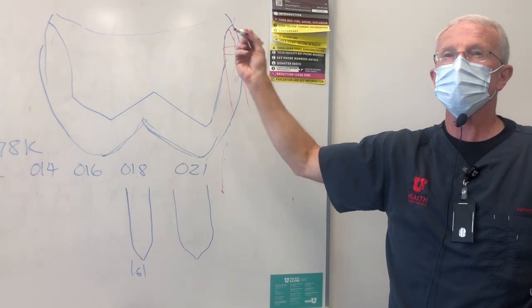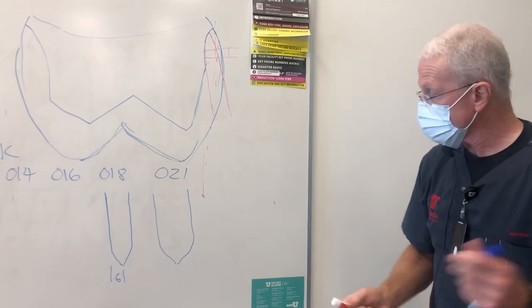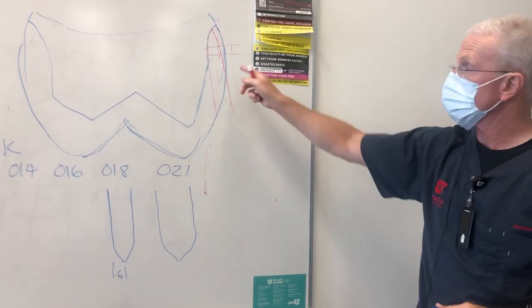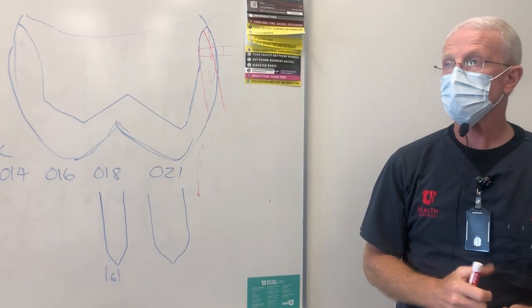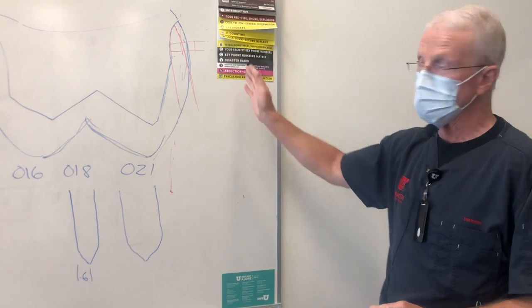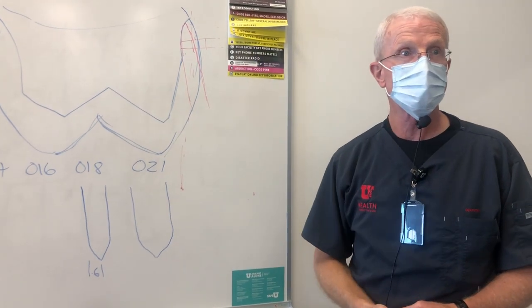So you can't precisely measure a chamfer margin depth without making a preoperative matrix, a reduction guide that you can measure from. And that's okay if you want to do that, but we're not going to be assessing them that way. We're giving you a 0.5 millimeter range that we want you to be within on the depth of your chamfer. And you can look at the examples that we've given you. The one I have is probably a light 1 millimeter. It would maybe be just under 1 millimeter, but it's deep enough. It's in that zone where it's going to be just fine. There's no reason to go really deep with these. When you do go deep, you're taking a lot of tooth structure off when you are up in the gingival third of the tooth because of the height of contour.